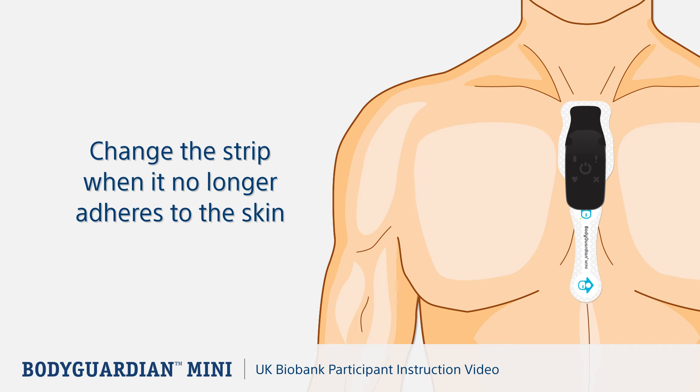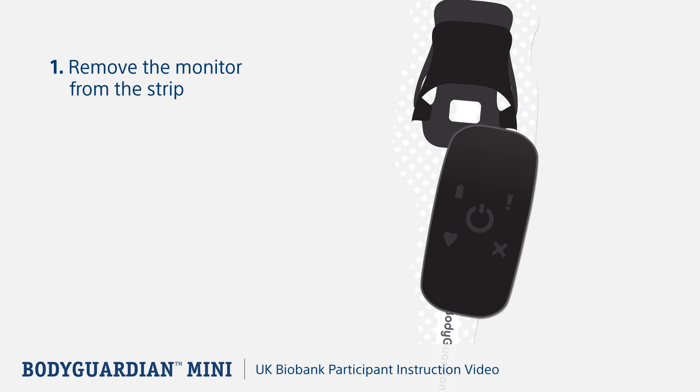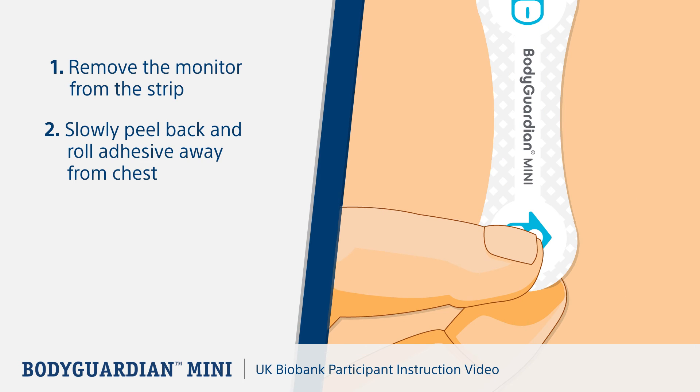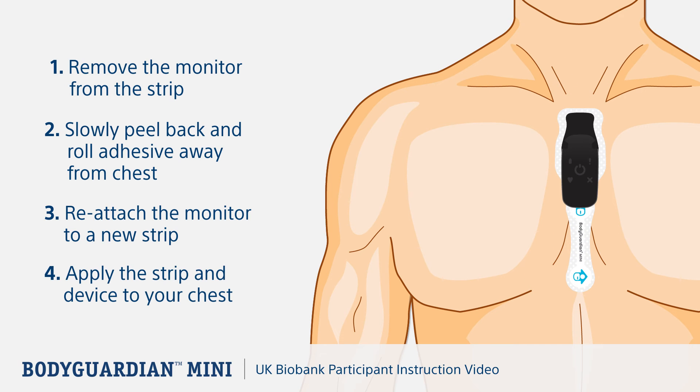Strips are disposable. Remove the strip while showering or use a warm, damp cloth to blot while removing. For easiest removal, remove the monitor from the strip. Slowly peel back and roll the adhesive away from your chest, continually blotting with water. Reattach the monitor to a new strip, then apply the strip and device to your chest.